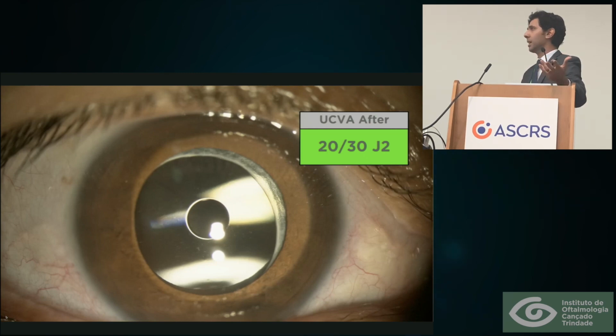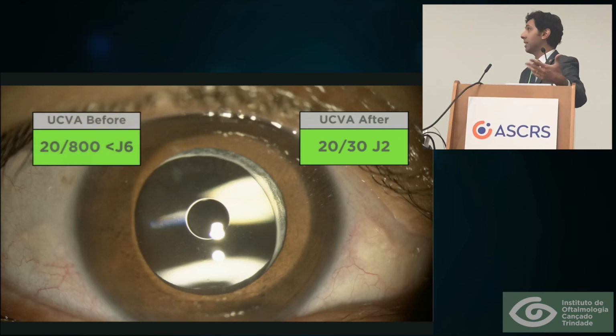We very frequently have an unexpectedly good result of a cataract surgery with a keratoconus like this. So this is the best way to get a wow factor at the end. It's when we can adequately combine a clear lens extraction or a cataract surgery and the pinhole implantation in the best candidates. So just to remind you, this is what she used to see before surgery.